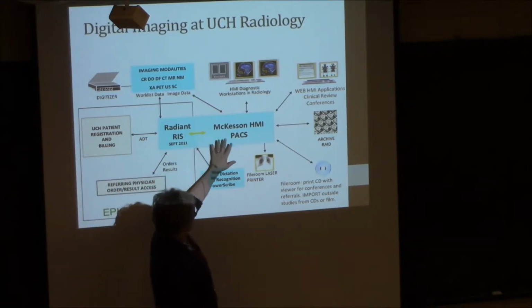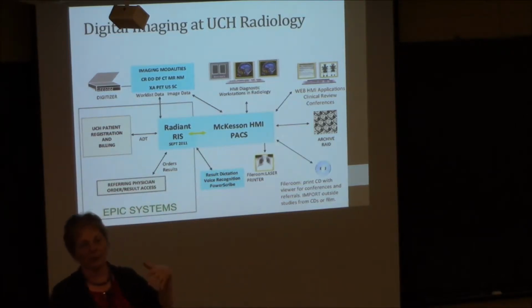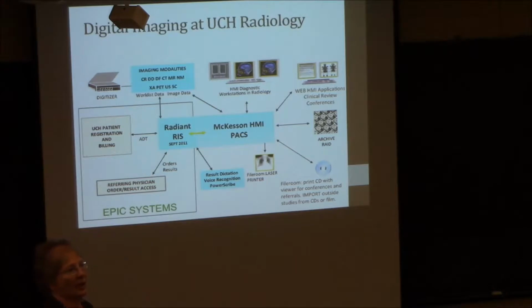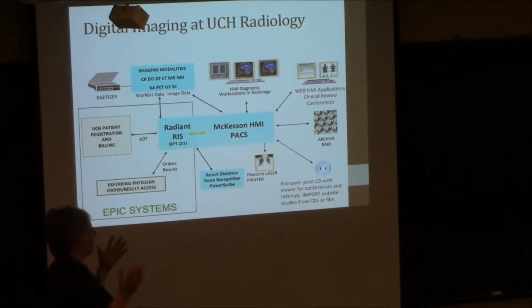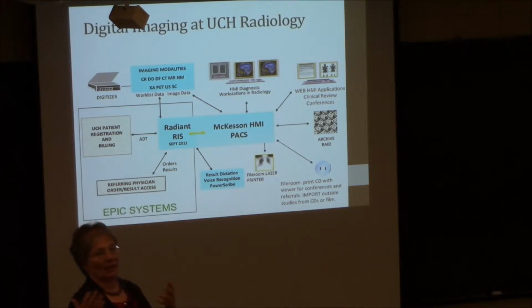And then we in radiology generate images, and so they have these systems called PACS, picture archiving and communication systems, that store the images. What's changing with those is, originally you think of an electronic file room. Basically everything is numbered and lettered, and you know where it's stored, and you go get it anytime you want. But it's expanded way beyond radiology now, so that a lot of departments do imaging: endoscopy, and all manner of imaging. The ER does a lot of ultrasound. And so we're now working on a massive project of bringing all of the images together.